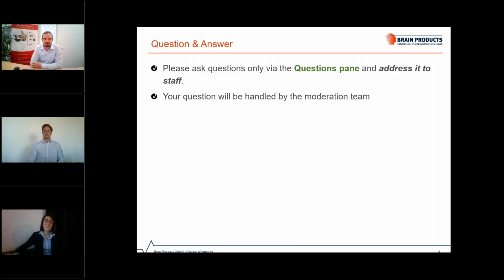Perfect, thank you. A question now for Eduardo. The long-lasting cream that you mentioned, which won't dry out for long measurement and long acquisition times, can this be used for simultaneous EEG and fMRI studies? I would say, well, this is actually designed for active electrodes, so you can't really use active electrode technology within the scanner environment, I'm afraid. So I am not sure whether this can be safely used in the MR environment. I would check with the actiCHamp team and let you know.